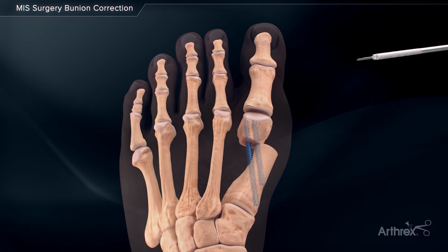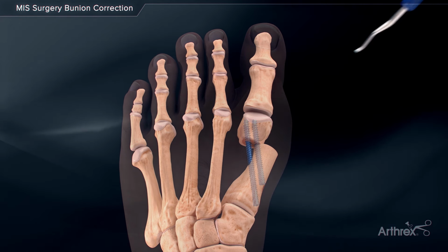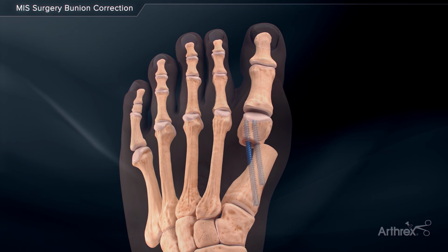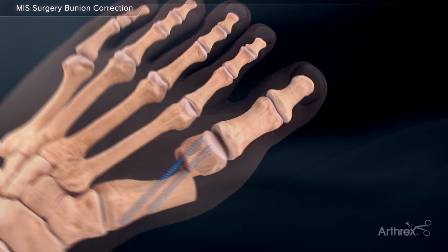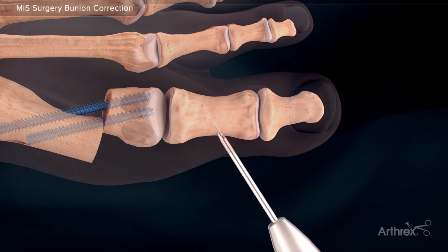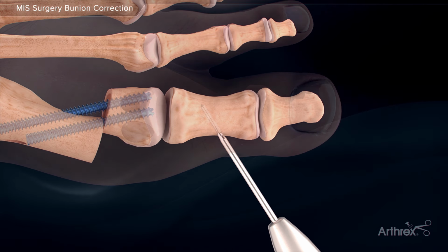Initially, a 5 mm incision is made midline on the hallux in line with the intended starting point of the osteotomy. After blunt dissection is carried down to the bone, the periosteal elevator is utilized to create a dorsal and plantar working space for the burr. The 2 mm by 13 mm burr is introduced midline, aiming for distal medial to proximal lateral in order to create a medial wedge osteotomy.